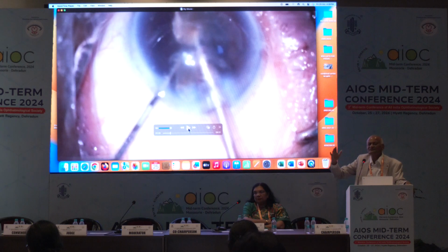So what will you do? You will have to brake the motor. In phacoemulsification, complications normally happen here because you are not braking the speed. So can anybody tell me how much brake you should apply and when you should do it?